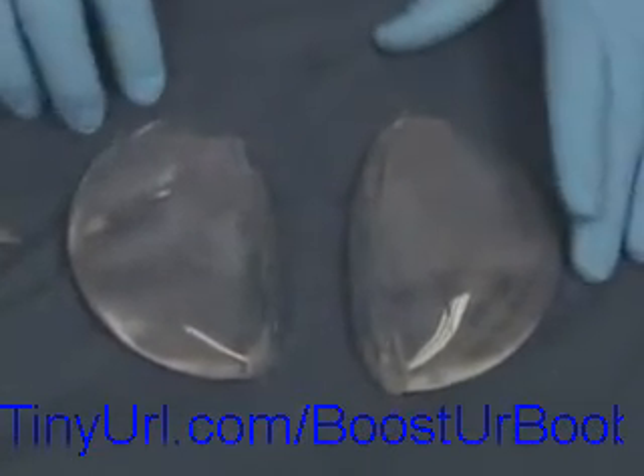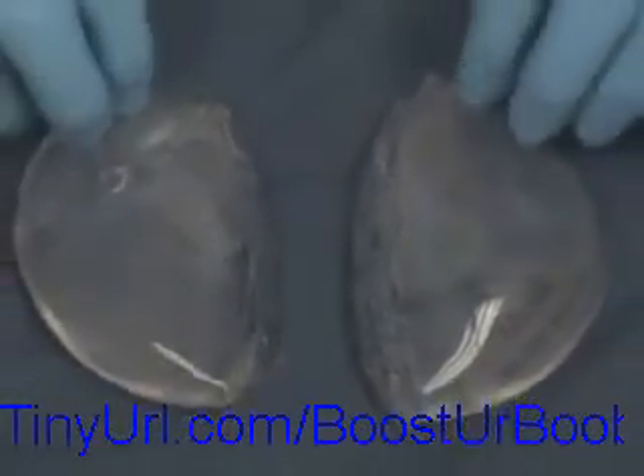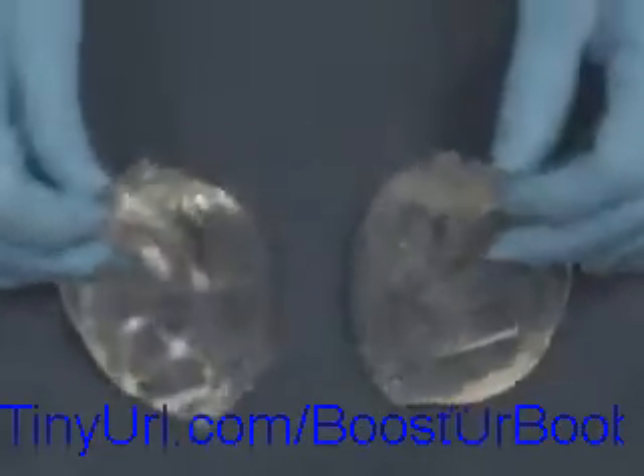Currently about eighty percent of my patients choose silicone gel implants instead of saline implants. These are typically softer. There are some FDA restrictions — you must be 22 years of age to have access to these implants. But I do believe it's a safe implant, and it's quite an interesting demonstration to see what happens with the silicone.